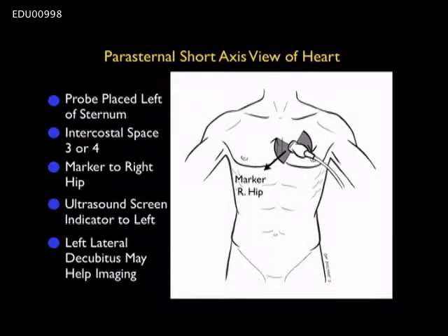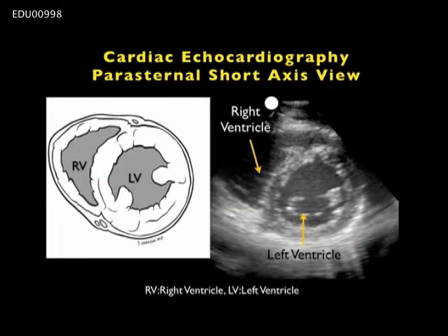Let's move on to discuss the parasternal short axis view of the heart. A pearl here: don't take the probe off the chest once you've obtained the parasternal long axis view. Simply rotate the probe 90 degrees clockwise so the indicator dot is now down towards the patient's right hip — with the caveat that the ultrasound screen indicator dot is positioned to the left of the screen. Moving the patient into left lateral decubitus position may again help imaging. From this view we're imaging the heart in cross section, seeing the left ventricle as a cylinder to the bottom right and the right ventricle to the upper left.